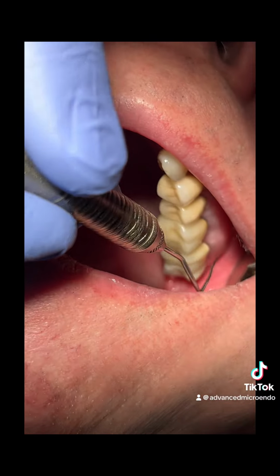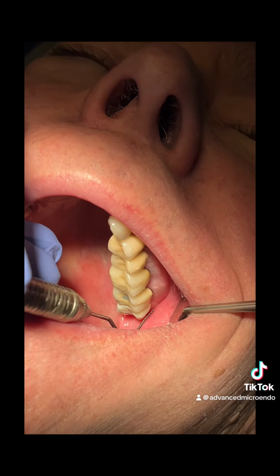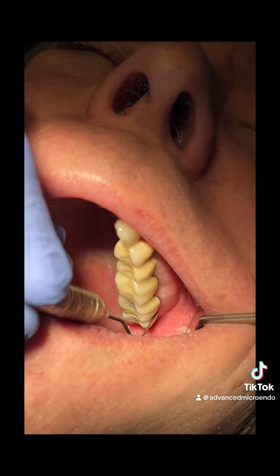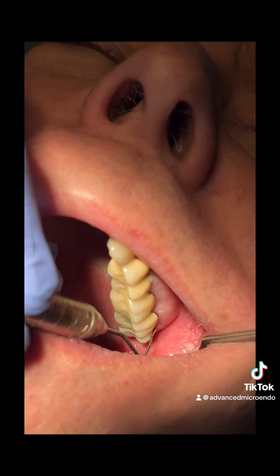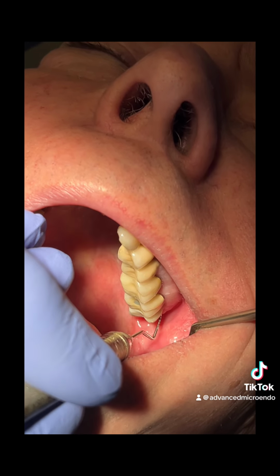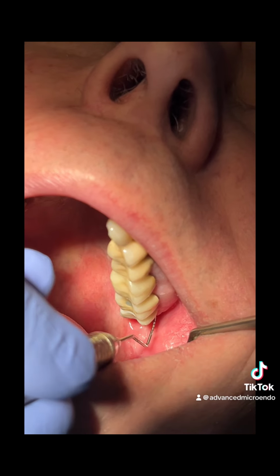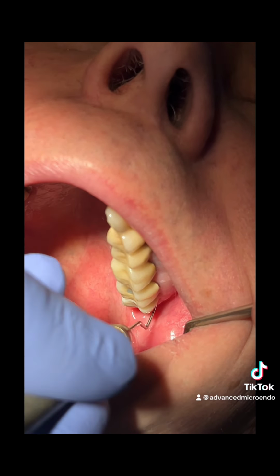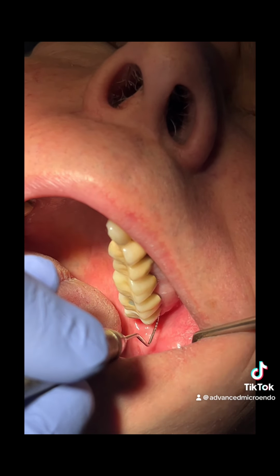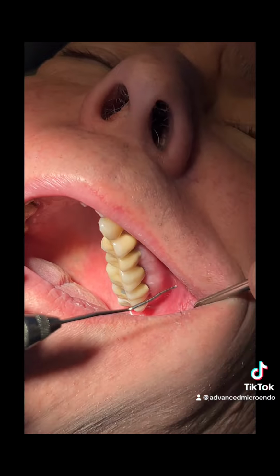I take the measurement, so you ready? Go ahead. All right, so tooth number 15, the probings were 2 to 3 millimeters. Let's probe the wisdom tooth, number 16, and you walk the probe and take a look here. I'm down to right now 9 to 10 millimeters on the wisdom tooth, and it just sinks right in, right there. Okay, very good. Thank you.